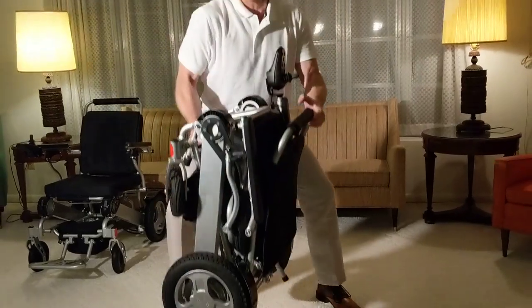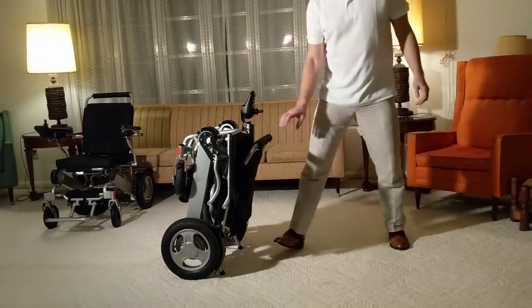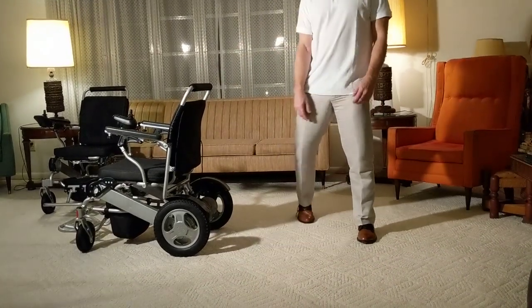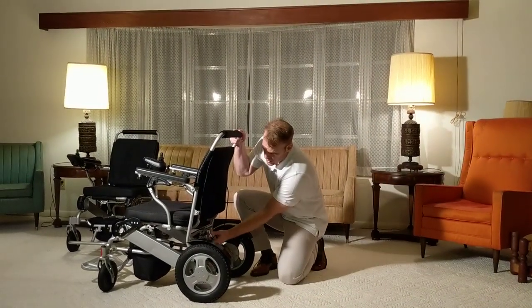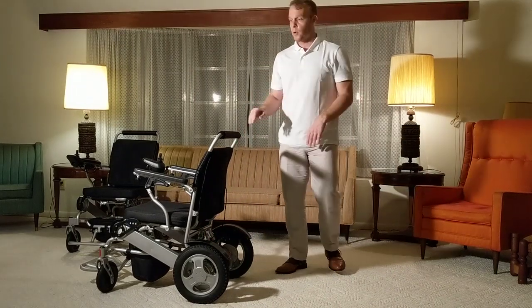When you're ready, this chair requires almost no effort to unfold, latch, and be a perfect power chair.